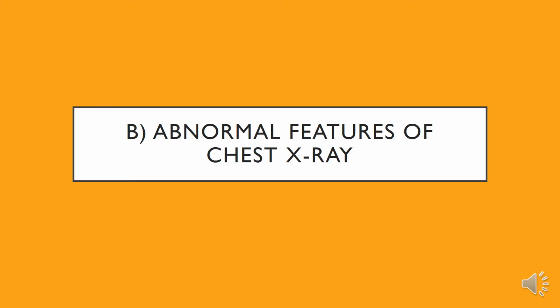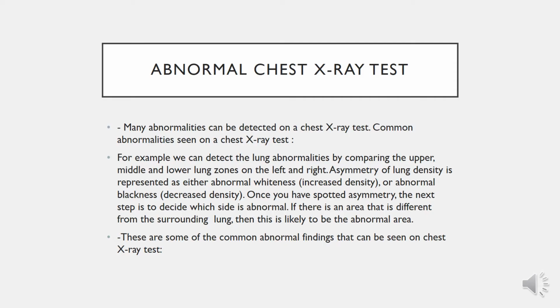Now, we'll talk about the abnormal features of a chest X-ray. Abnormal chest X-ray test. Many abnormalities can be detected on a chest X-ray test. Some of the common abnormalities that can be seen on chest X-ray tests.